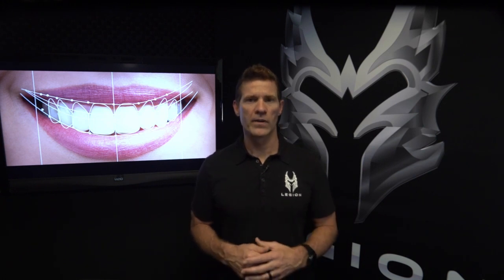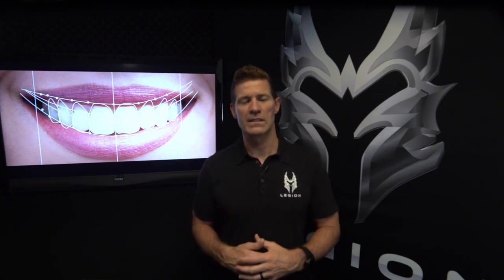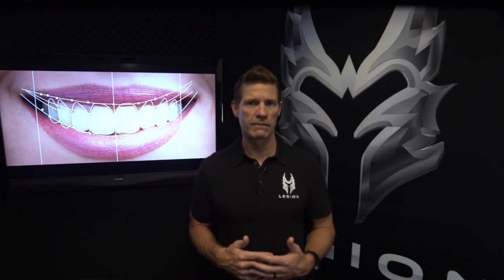Now we can also evaluate the smile line of the lower lip to see if it's in harmony with the incisal plane of the teeth. I then look at the incisal edge position of the teeth. Do the teeth touch the lip? Do they follow closely the smile line of the lip? Or do I have to add space or length to a worn dentition?